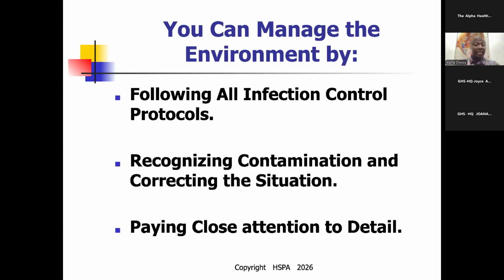You cannot leave the instrument in the chlorine for a whole 7 hours, where the night people will leave it and come the next morning. I have seen it when I was going around. You cannot say, I'm busy, so nobody is paying attention. Somebody should pay attention. Attitude, paying attention to details. If it is 5 minutes, please, 5 minutes, rinse it properly, per the manufacturer's instruction. Very, very important.